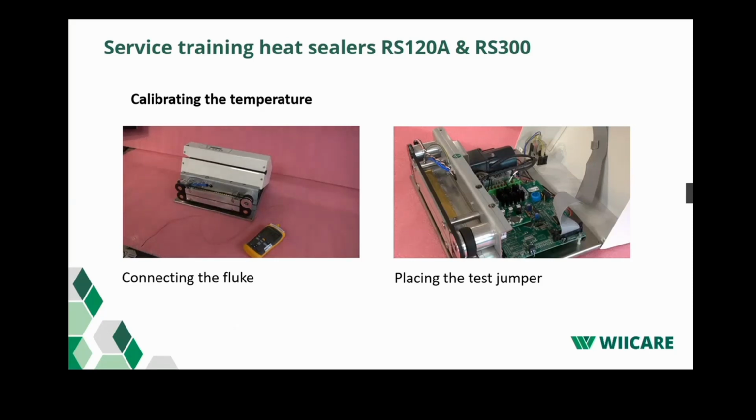Now we insert the sensor of the thermometer into the block of the thermocouple that is located at the bottom of the heating element. As an example, I will show it on a separate heating element. Make sure to put copper paste on it, otherwise you can get a wrong measurement. Now I will put it into the actual sealer.